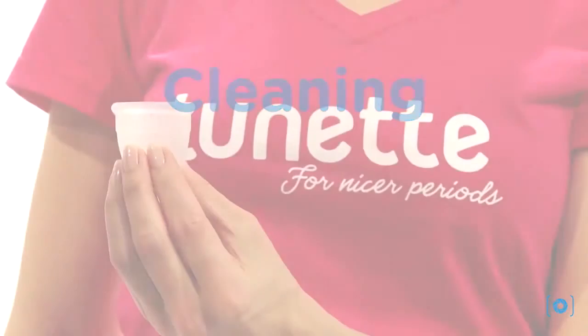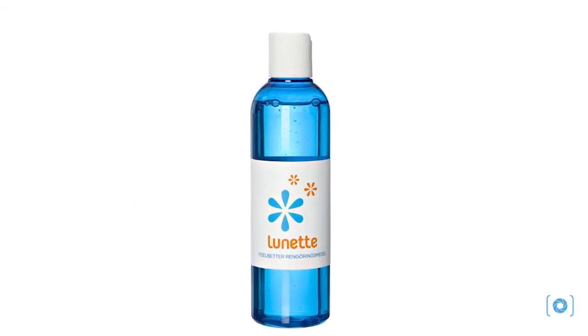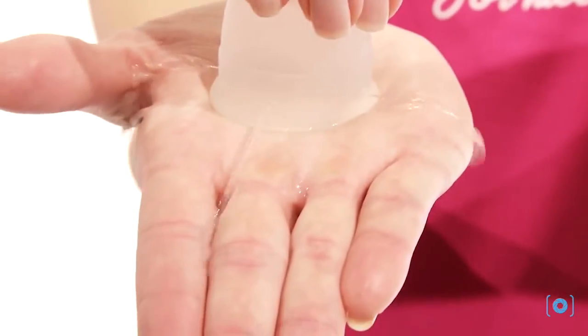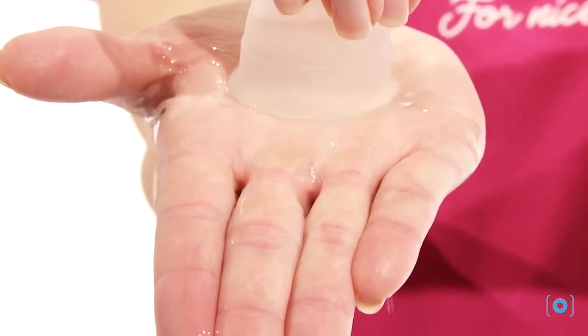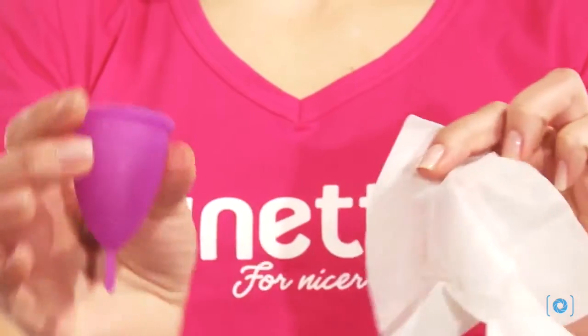First rinse with cold water, then with warm water. You can also use the Lunette Feel Better Liquid Wash, developed specifically for cleaning silicone menstrual cups, and easily clean the air holes. After your period, boil the cup in plenty of water or use disinfecting Lunette cup wipes or rubbing alcohol.